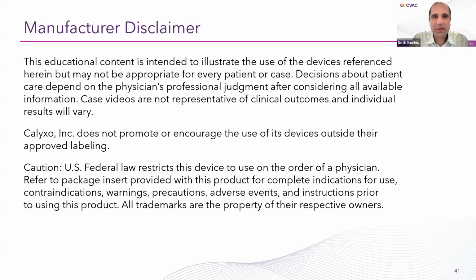So taking that extra time up front to really treat the stone ultimately translates into a faster, more efficient case. And if I could just add too, some of the learning points, maybe not so much for me, but from other providers in my health system who I've spoken with, where people ran into challenges were, first, those who were maybe a little cavalier and felt that they don't really need to have someone in their room, a clinical support specialist from the company, to help take them through things.